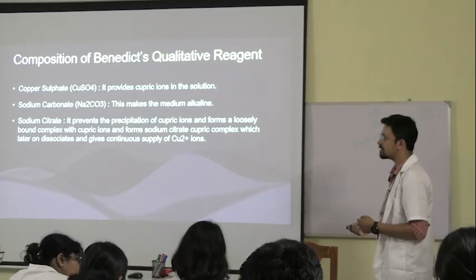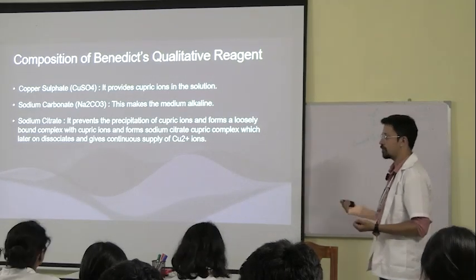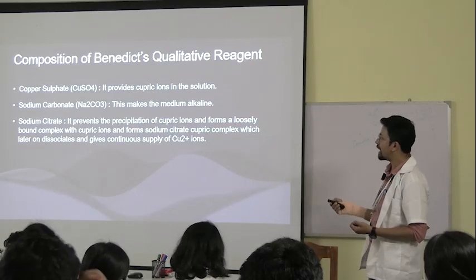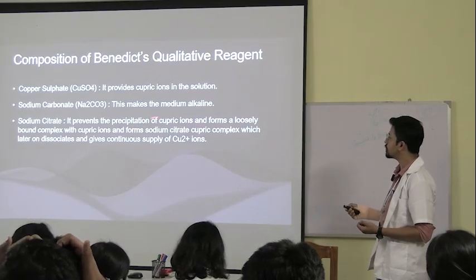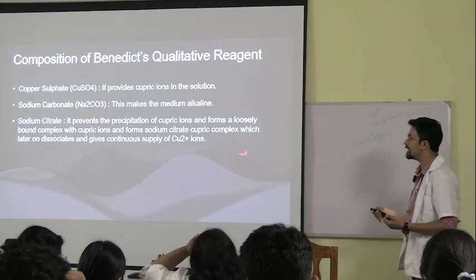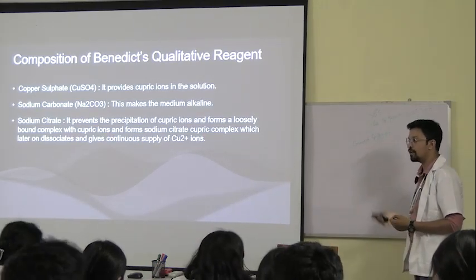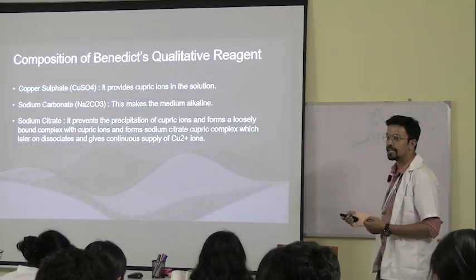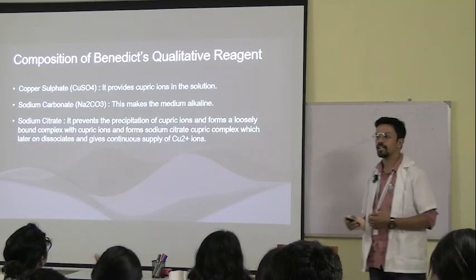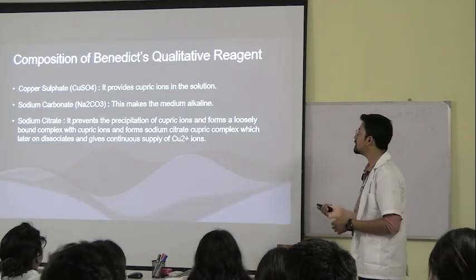You have to remember this, you have to learn all these things by heart, can't help it. These are difficult, but you have to remember. So sodium citrate binds with copper's cupric ions, forming a sodium citrate cupric complex, which is a loosely bound complex. Later on it dissociates and gives a continuous supply of the cupric ions to the reaction. Any doubts? Anybody has any doubts? Wow, very good. Nobody has any doubt.